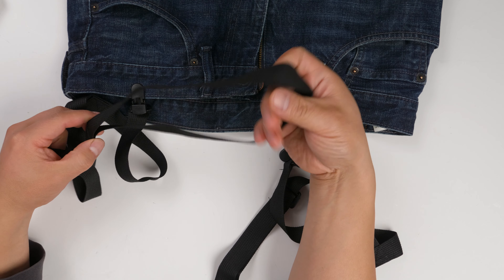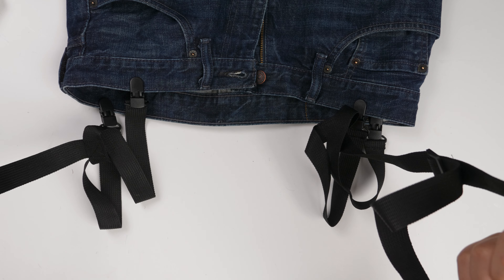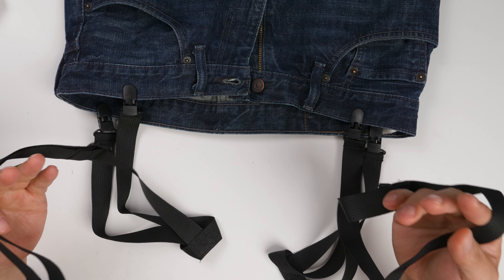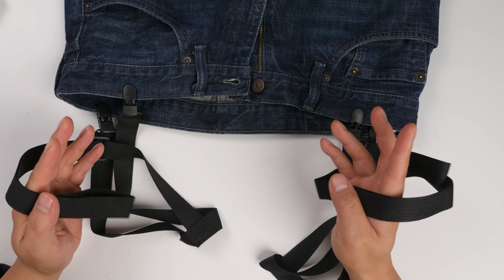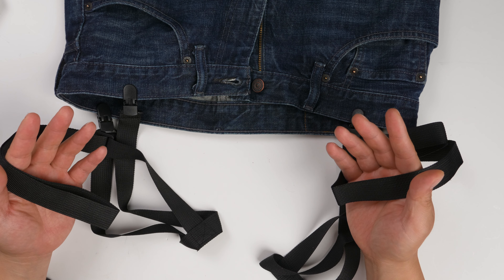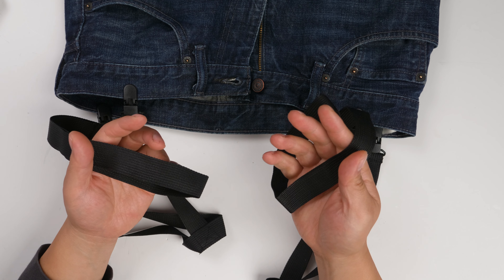You can grab it like this, grab this part — your pants is under control. You just pull and you can put your pants on without needing to bend over. That is very easy for seniors or maybe for pregnant women. This is a very good gift for the person that needs this.